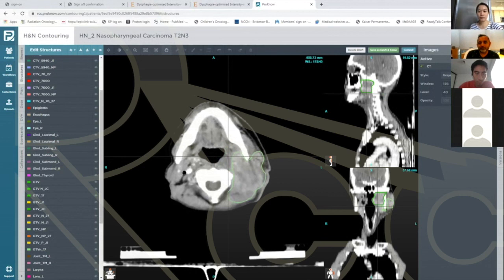So here you can see, compared to the contralateral side, the retropharyngeal space right there, constrictors right there. You can see level 2A nodes, level 2B nodes. Here's that sternocleidomastoid. You can see why being skinny does not pay in head and neck cancer, right?